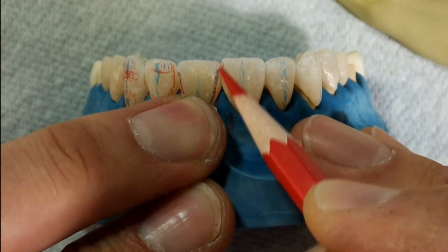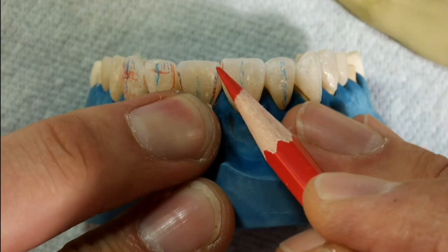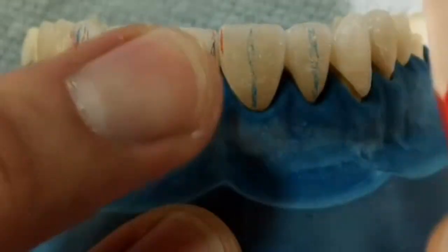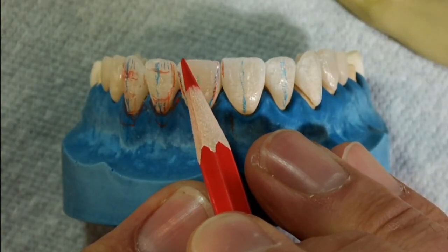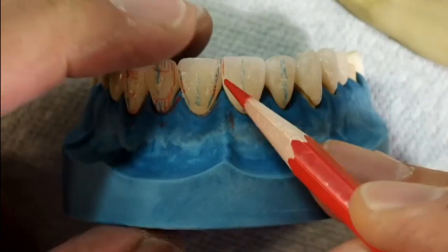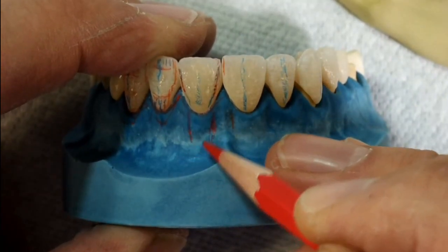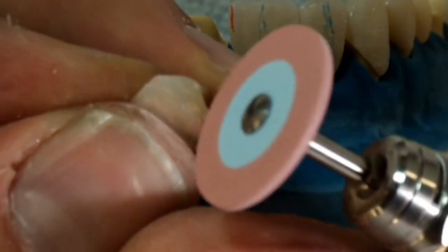Different tooth shapes have different outlines of the line angles. On a square tooth, the mesial and distal proximal surfaces are parallel to each other and perpendicular to the incisal edge, and slightly curved. On an oval tooth, the outline is more narrow at the cervical and more square at the incisal. On a tapered tooth, the outline is much more narrow at the cervical and much wider at the incisal edge. All line angles at the cervical area are basically an extension of the root, transitioning into the root area.